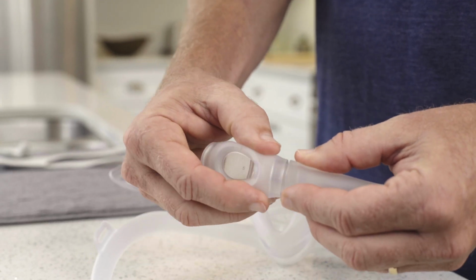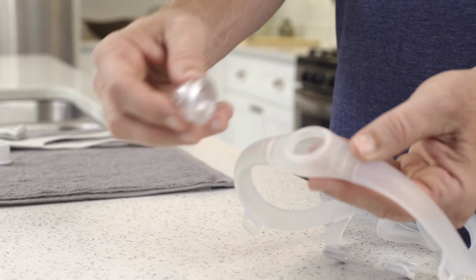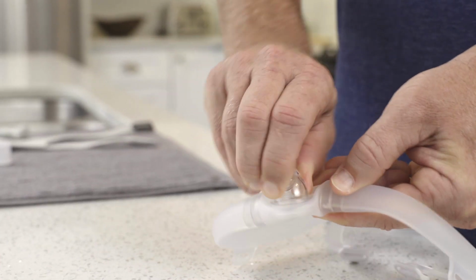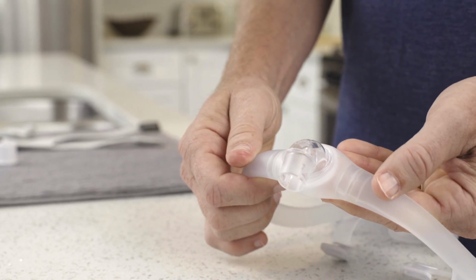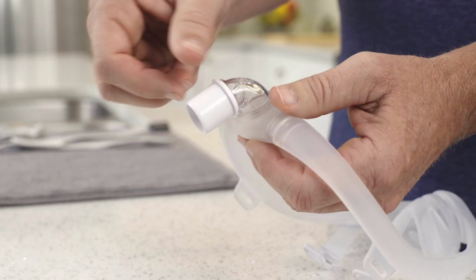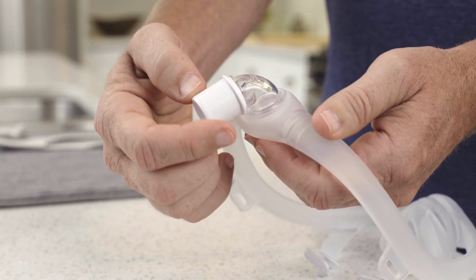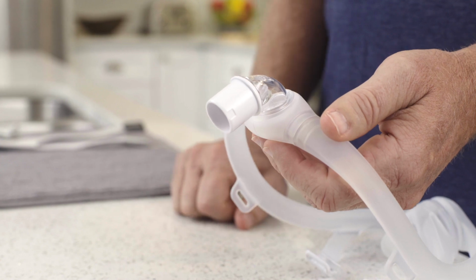Click the sizing connector into the mask frame tubes. Insert the elbow into the top of the frame sizing connector. Place the tubing quick release onto the elbow or into the CPAP hose. Notice that the elbow and tubing quick release have 360-degree swivels.